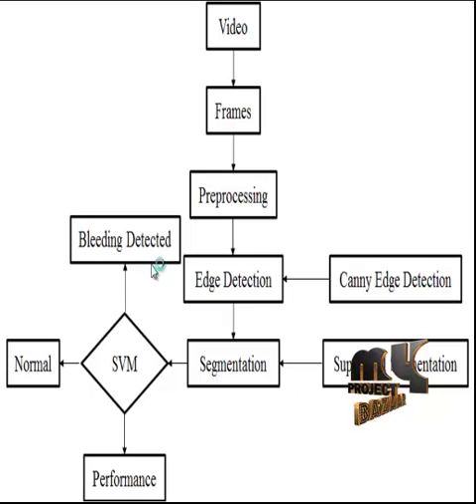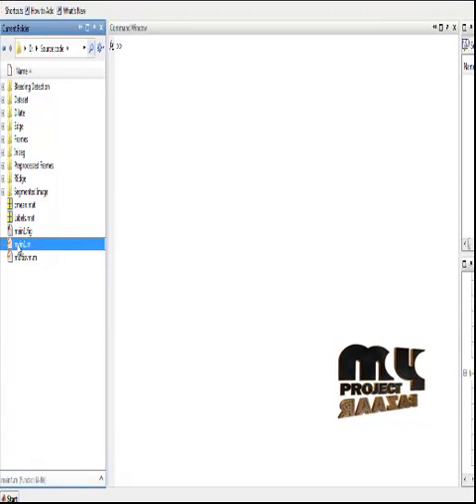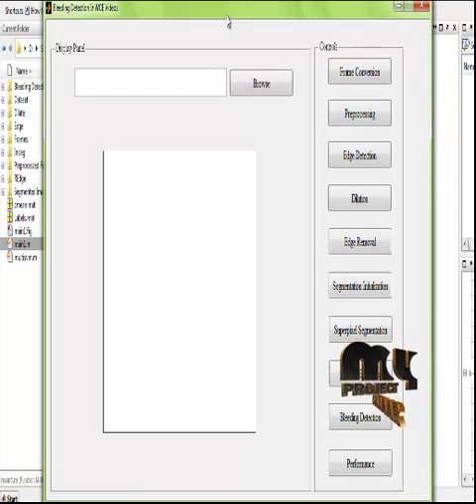While the bleeding detected regions, the detected bleedings were segmented based on application of the thresholding operations, which differs on each image. Let me show the running procedure of the process. If you want to run the code, select the file main1.m, which is located in the source code folder. Right click it and click on run file.